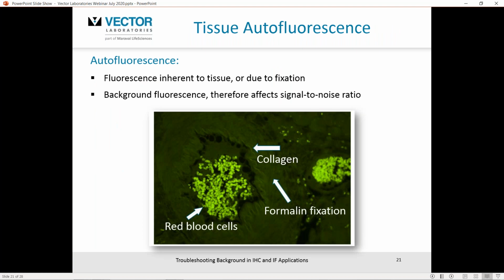An area that investigators do struggle with in immunofluorescence, that you would not encounter with immunohistochemistry, is tissue autofluorescence. And certainly, as I've shown here in this image, there are a lot of autofluorescent compounds in tissue. Red blood cells are particularly notorious. Various proteins such as collagens, elastins, and certainly you do see autofluorescence induced through the use of an aldehyde fixative such as formalin, formaldehyde, or glutaraldehyde. If you do see these, they certainly are not just within the green spectrum that we've shown here. It's across the spectrum as well into the red and far red areas.